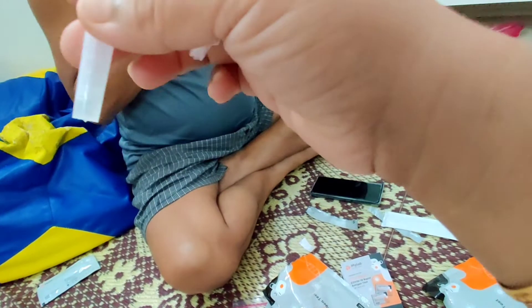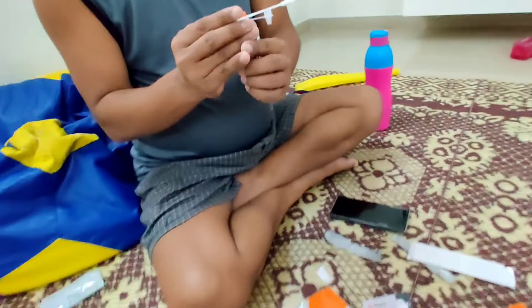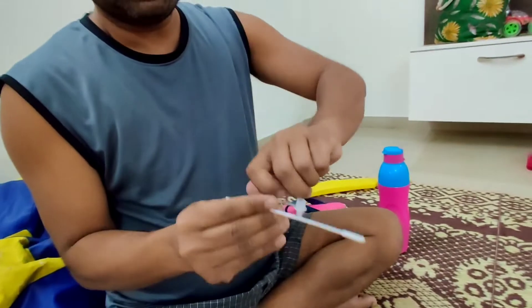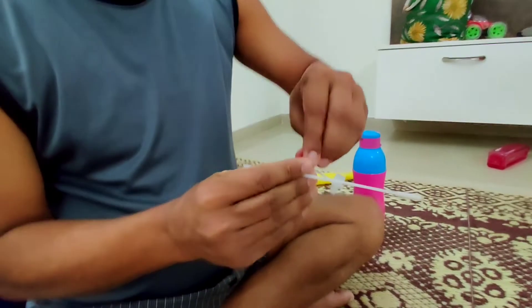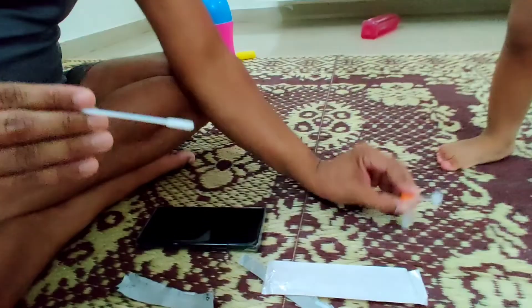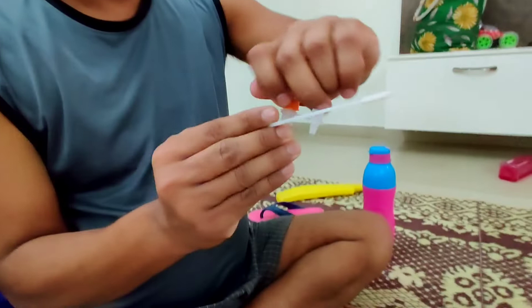Now you have to take the liquid, tap and settle it. Put the stick in it and remove the stick from the back, so the liquid will settle down to the bottom, because it is very small.